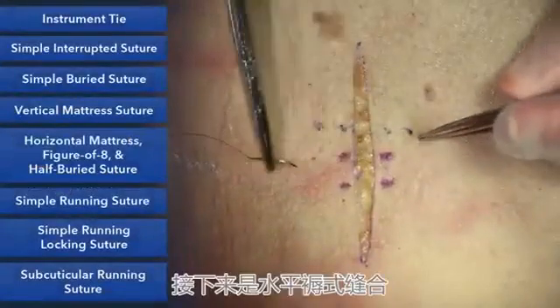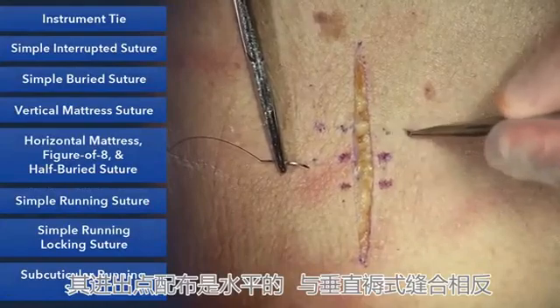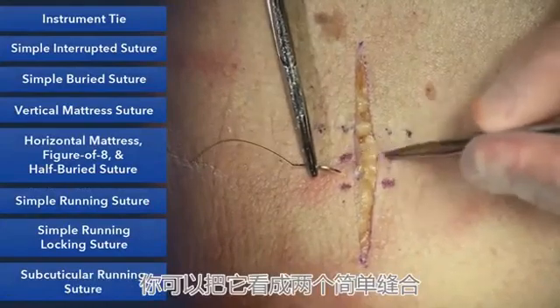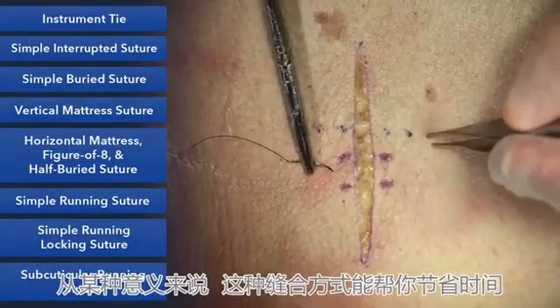Our next suture is the horizontal mattress suture. Its configuration is horizontal as opposed to our vertical mattress. You can think of this as two simple sutures. So in some essence, it's a simple suture, it just saves you some time.